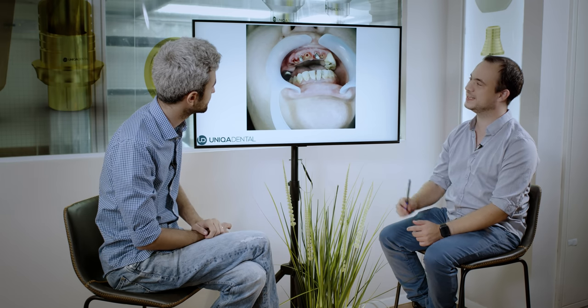Sometimes you want to change everything at once, sometimes you want to do it periodically — change one jaw, then the other jaw. Here we see it after the extractions. Three teeth remained. Those other teeth were extracted. We made root canal treatment and post and core, cemented to these teeth, for the temporary bridge to have better retention on those teeth. It's all temporary. Later on we'll extract those teeth also, but we wanted them to last at least five or six months until the implants integrate and we'll have a better temporary bridge and later a permanent zirconia bridge.